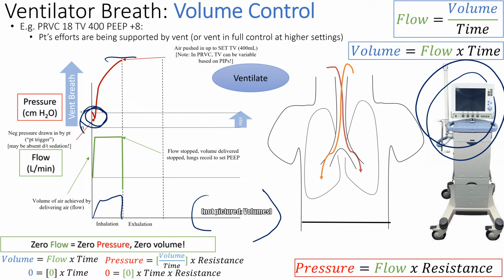We don't know what pressure it's going to meet, but it will meet a certain pressure, and that's what we're keeping an eye on, the pressures at all times, right? And the patient's efforts are supported with some volume control modes, and sometimes they're not. But in this case, it detected a little breath. If the breath didn't come, then it would automatically just give you a breath, and you won't see that little dip in the baseline.